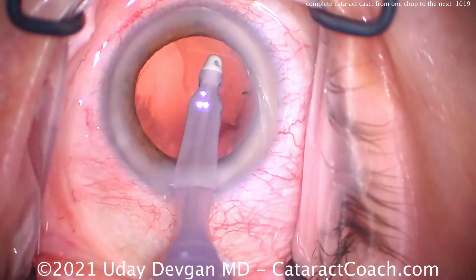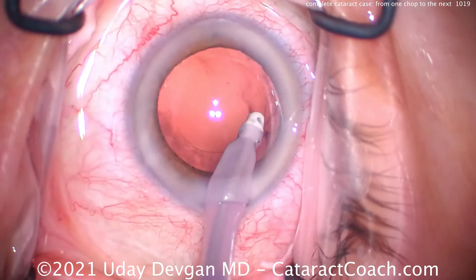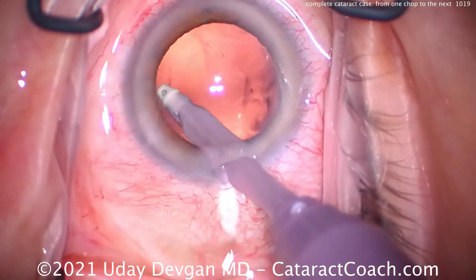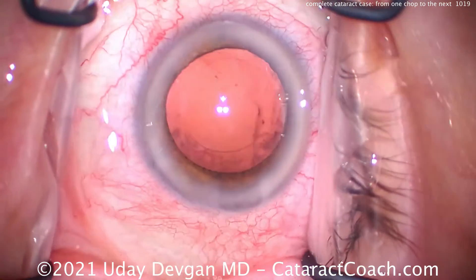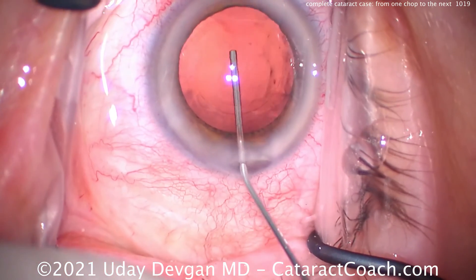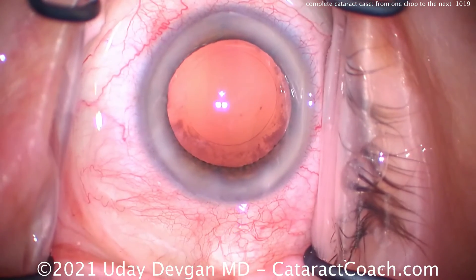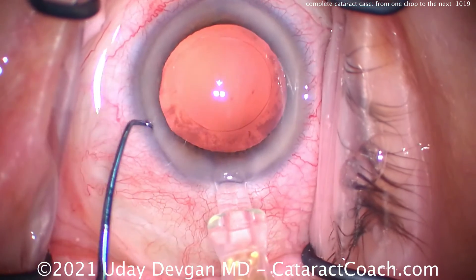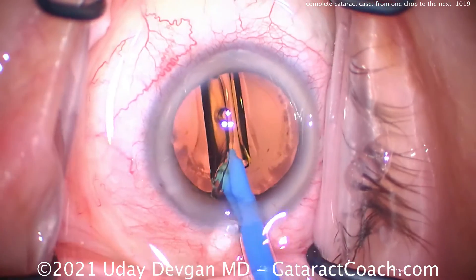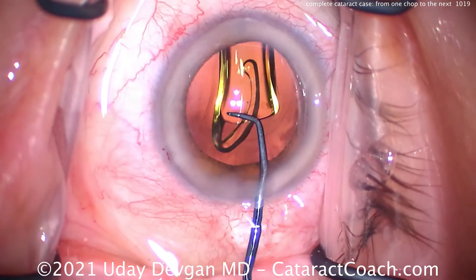A little capsule polishing here, cleaning up as much of that lens epithelial cell material as we can. Then we'll get the lens in the eye. The IOL is going to be a single-piece acrylic lens, very standard, non-toric in this case. We're ready to fill up our capsular bag with viscoelastic. If we had a bimanual setup, we could do more capsule polishing in that sub-incisional area, but in this case we're going right to placing the IOL. Single-piece lens, preloaded injector, chopper to fixate the eye via that paracentesis — we'll get this lens dialed into good position.